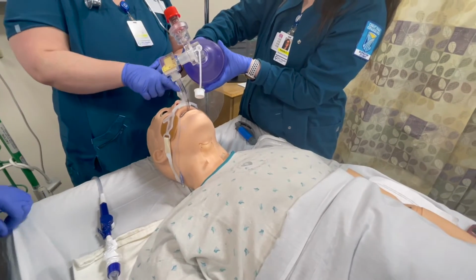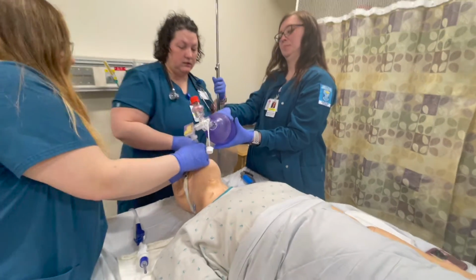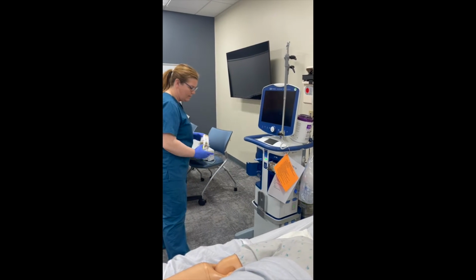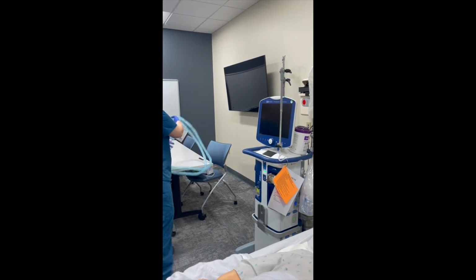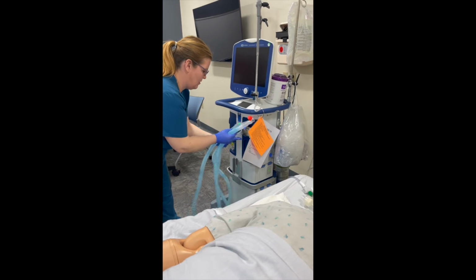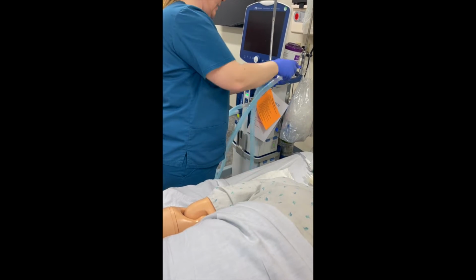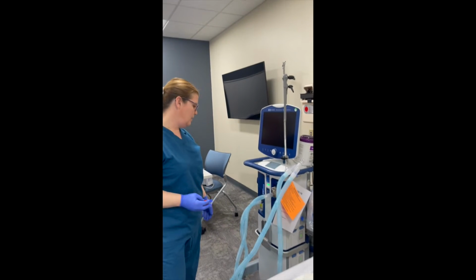Okay. Are we gonna order an x-ray? I'm gonna go order the x-ray. You guys get them hooked up to the ventilator. I will go get the ventilator. Good job. Okay. So we're gonna go ahead and connect our circuit to our ventilator. Turn that on.